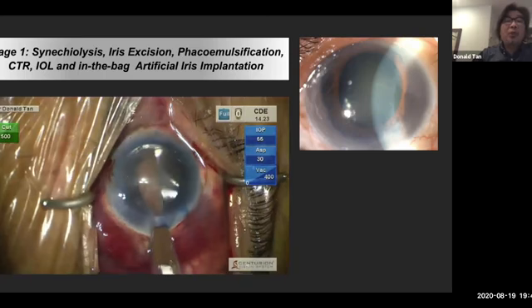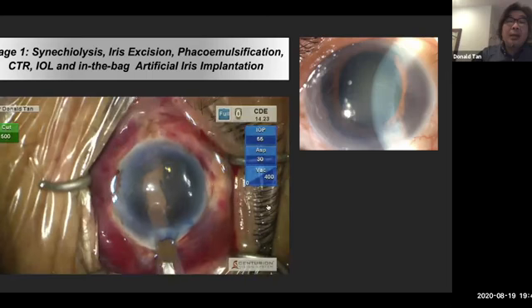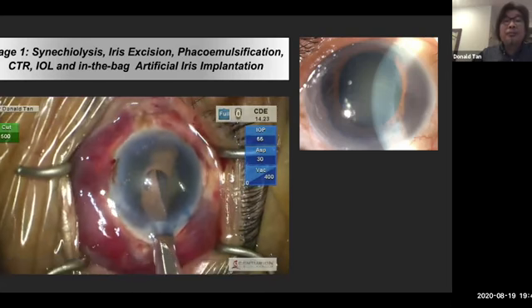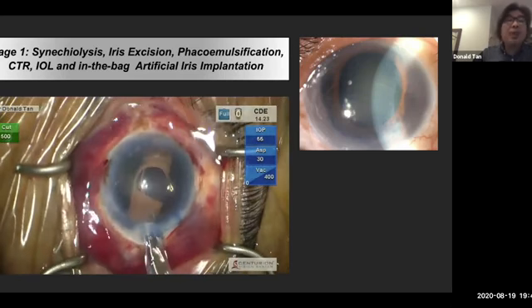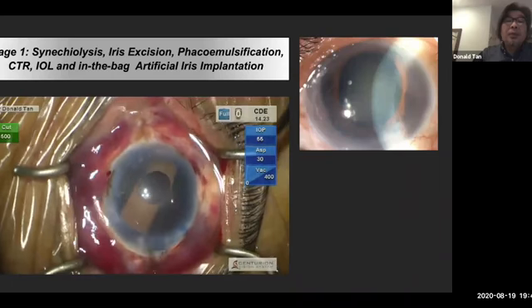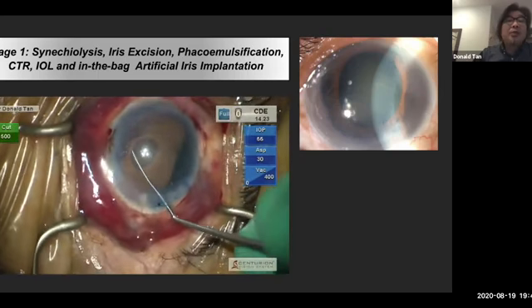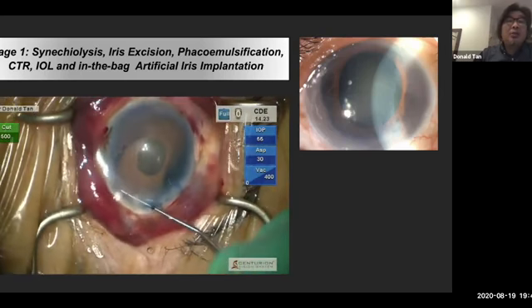And very important, make sure that the front edge of the iris is in the bag and this pupil is facing forward so it doesn't flip the other way around. Now this is pretty bulky, and one has to be quite careful because if you split this bag, it's a problem. Okay, and then it's a little bit of maneuvering to open up the flanges of this iris and to tuck slowly under viscoelastic control to put this in.